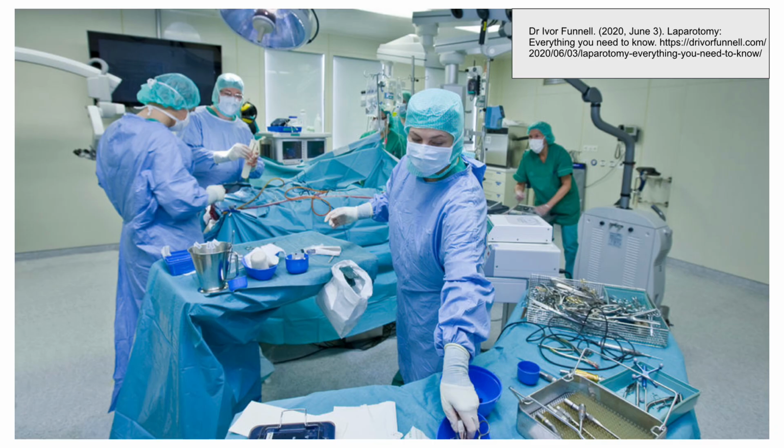Step 4. Closing the incision. After resolving the issue, the abdomen is usually closed in layers and a drain may be placed to prevent any excessive fluid and pooling in the abdomen. If the patient is expected to have another surgery or if there is significant amount of infection, the abdomen may be left open.